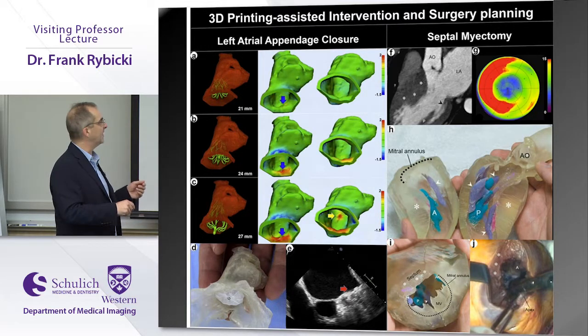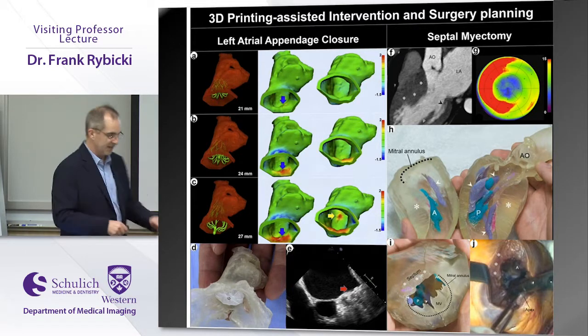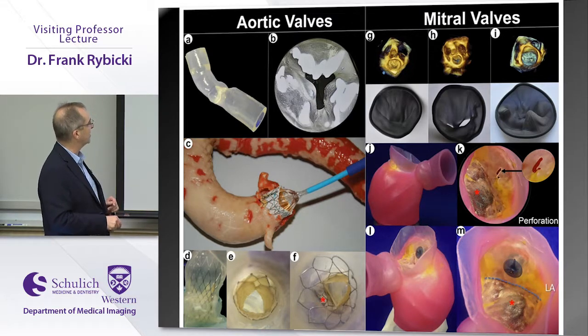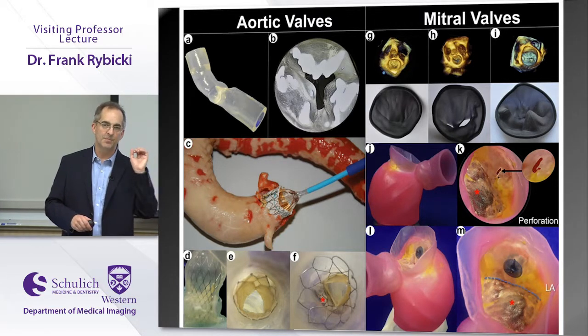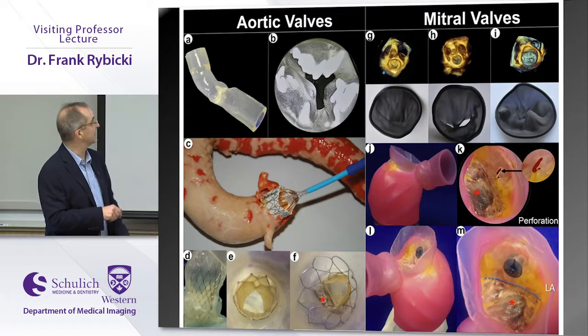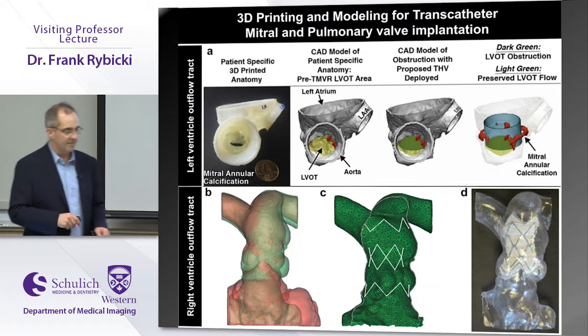The surgeon can cut it out if it's the right material, and there's all kinds of investment in different materials. You can print the valves. You can deploy different types of stents and different things in the cardiac domain. This is a TAVR where you're actually practicing deploying the thing. Not only that, but you can 3D print the valve so it custom fits. You can either print the titanium struts and lay the valve material on it, or you can 3D print the entire thing. There's a huge business now in 3D printing the mitral domain as that enters the field.